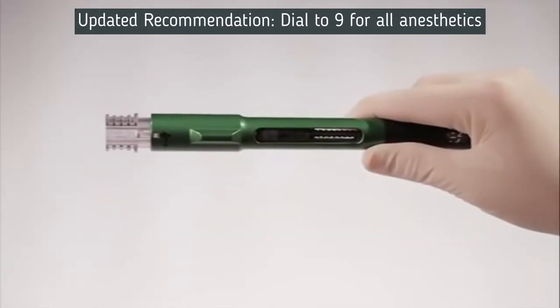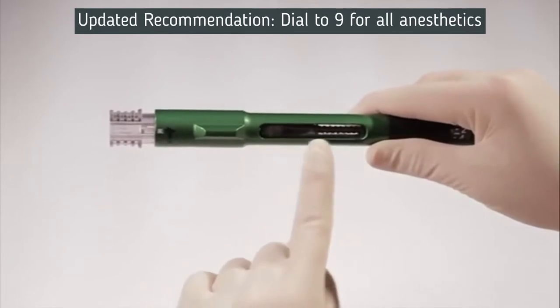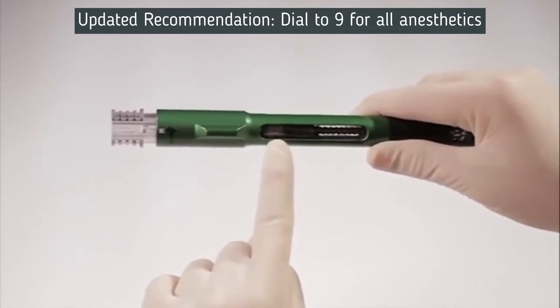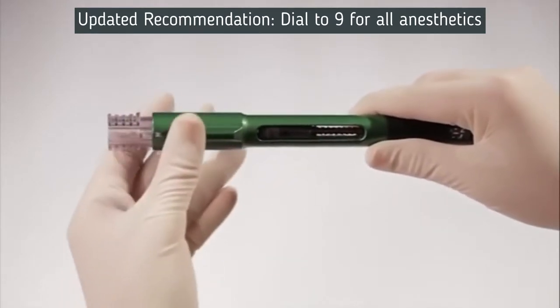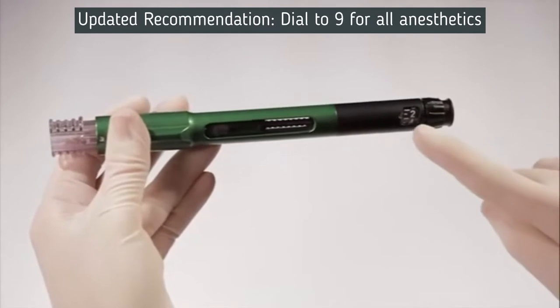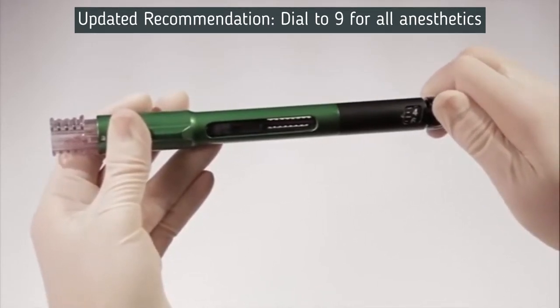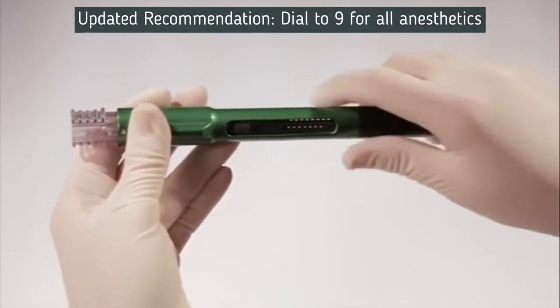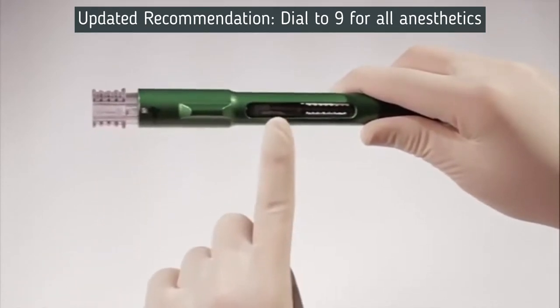To determine when to change the 3-milliliter cartridge, check the pen's chamber window. When the plunger of the 3-milliliter cartridge reaches the bottom of the cartridge chamber, the cartridge is empty and needs to be replaced. Another indication that the 3-milliliter cartridge needs to be replaced is if the volume dial will not dial to the desired amount of solution to be mixed. Always replace the cartridge connector at the same time you replace the 3-milliliter cartridge.